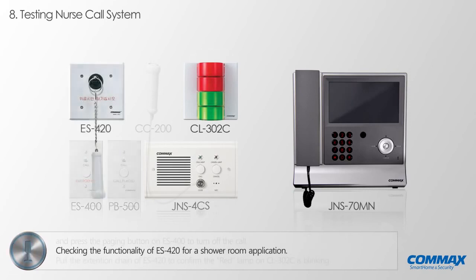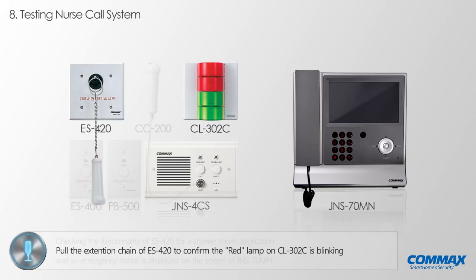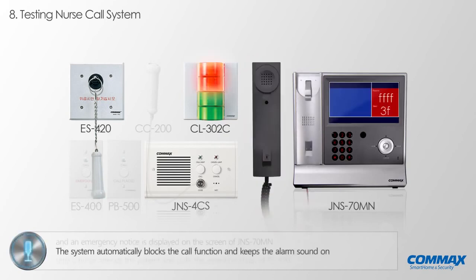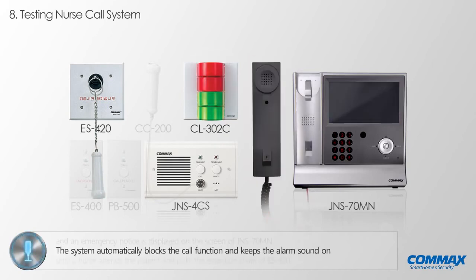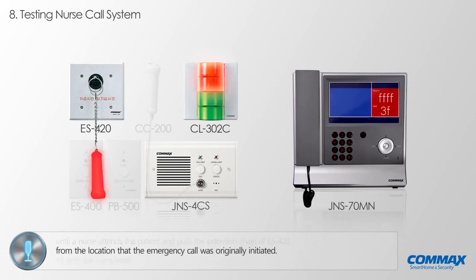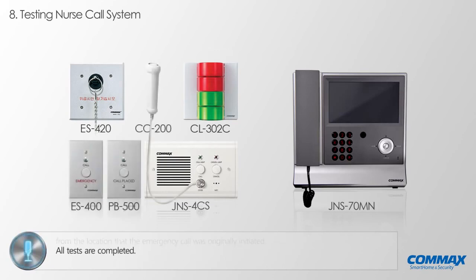Now let us check ES420, an emergency paging switch for a shower room application, for its functionality. As you pull the extension chain of ES420, confirm the red lamp on CL302C starts blinking, and an emergency notice is displayed on the screen of JNS70MN. Now the system automatically blocks the call function and keeps the alarm sound on until a nurse attends the patient and pulls the extension chain of ES420 from the location that the emergency call was triggered. All test procedures are completed.